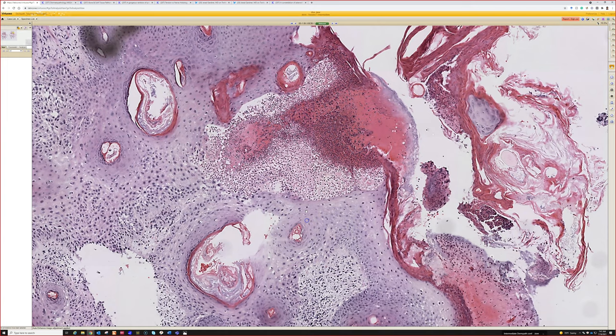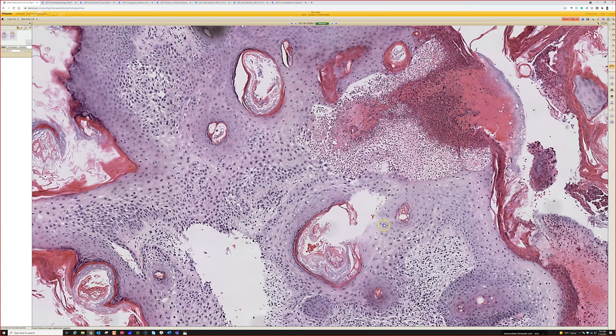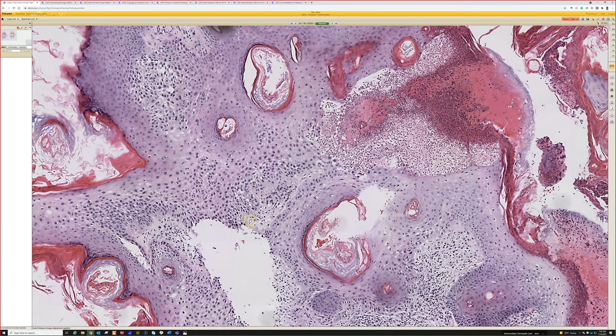That's perfect, and I like that you're confused by it because that highlights the downside of doing a curetting and submitting that for path instead of a shave biopsy or something. I'm not saying it's always inappropriate, but if you're expecting a path answer, curettings are not going to be an ideal specimen. It's going to be harder for us as pathologists to sort out what's going on and increase the likelihood that we'll hedge.